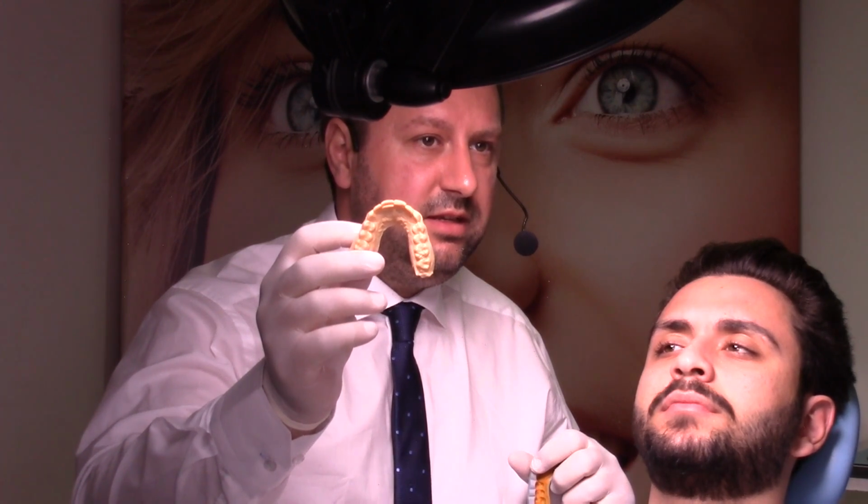A question, please? Yes. Dr. Iliev, I would like to ask you, once you send us through the STL file the new aesthetic proposal, can we do any corrections or adjustments to the final design that you proposed, or is that it? At the moment, you have two free corrections.